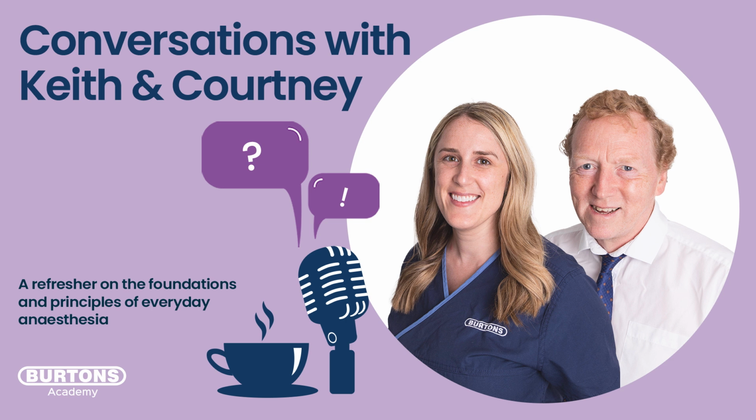But I think everybody who's ever used a pulse ox in the theatre, when it says 87%, isn't going to believe it that first time, are we? It's not right, because the first thing anybody's going to do is question that, move the pulse ox, reposition, and see if you get the same reading again. If you persistently get 87%, then you might start to believe it. But there are a few other reasons why we might see poor values, I think. And I think you've got some thoughts on that as well.